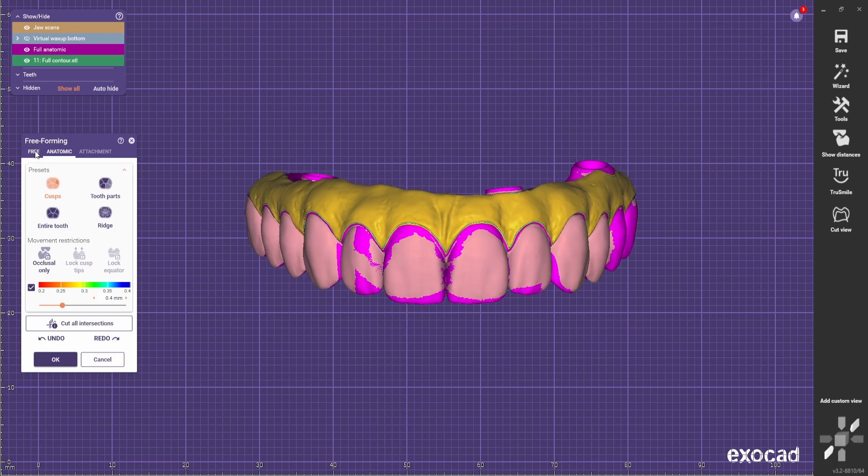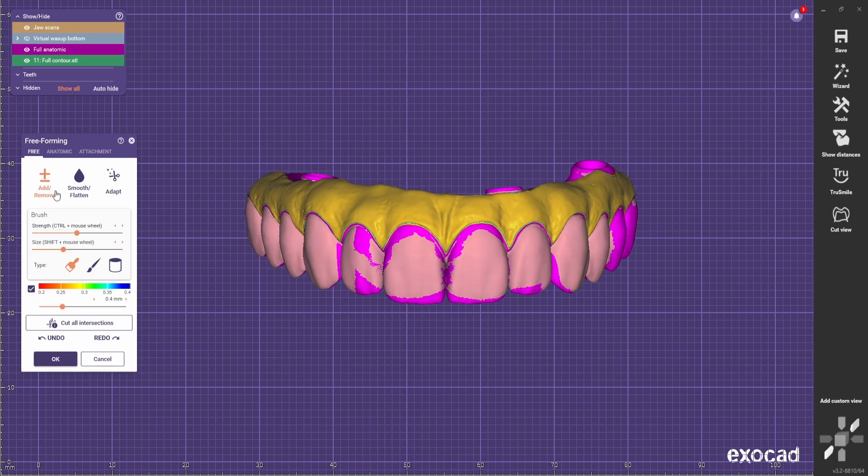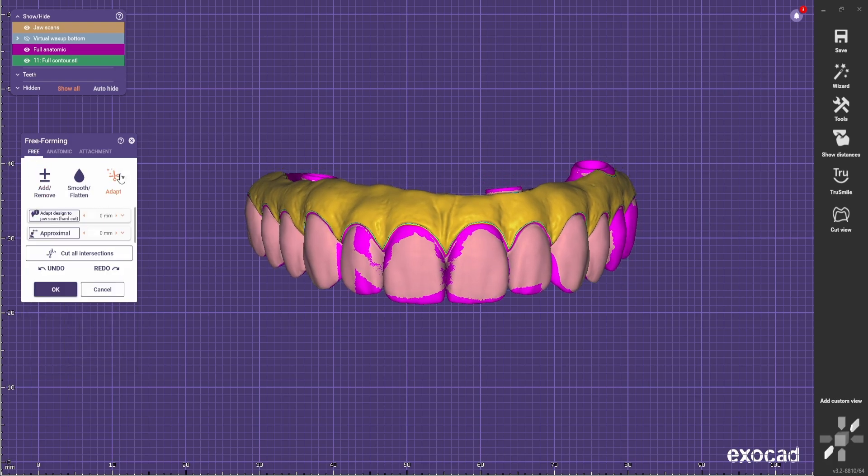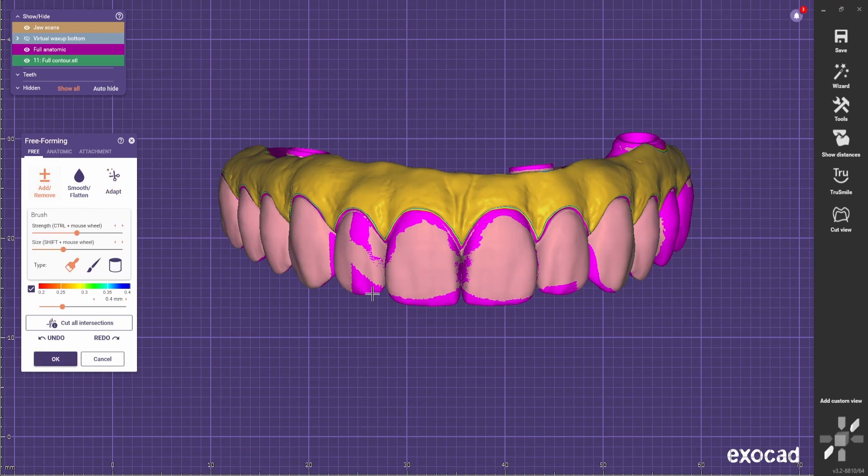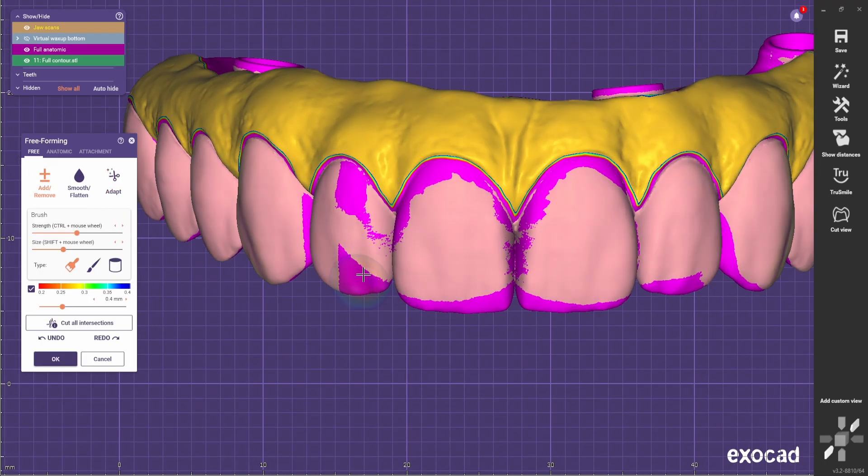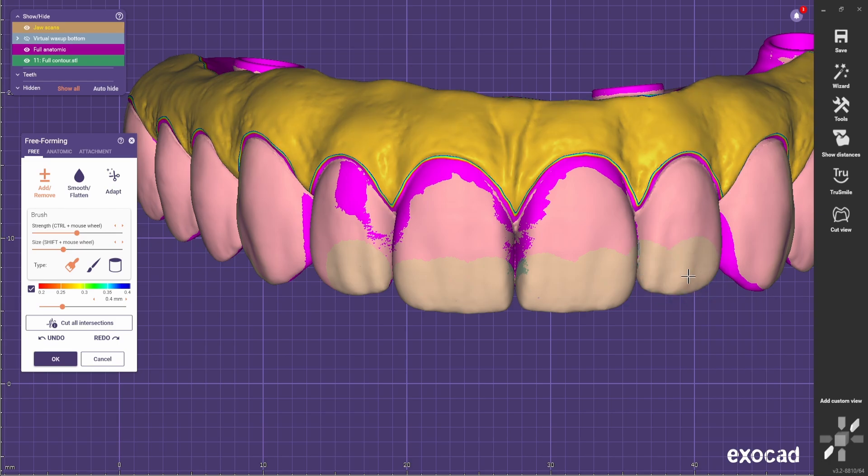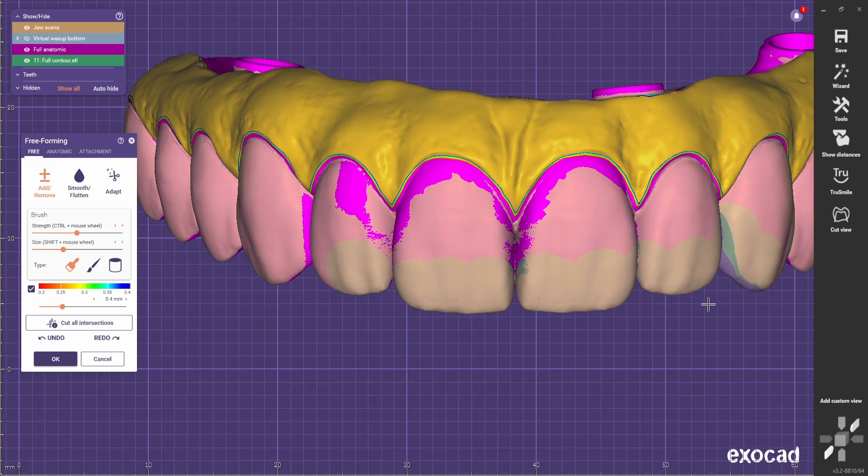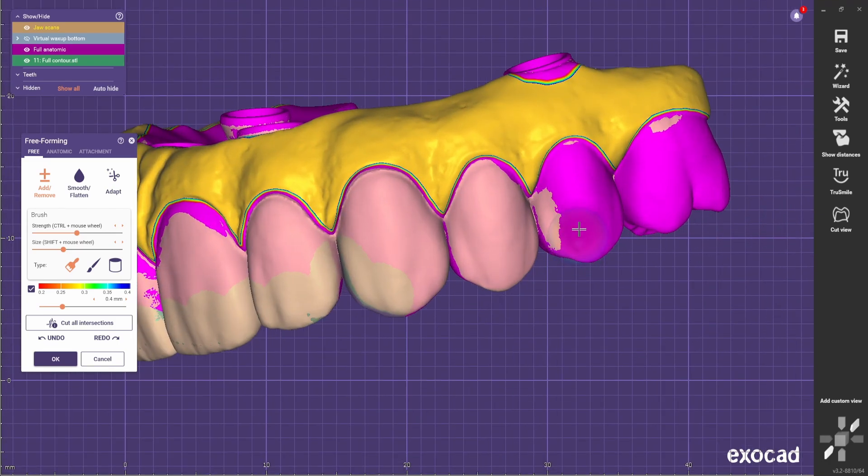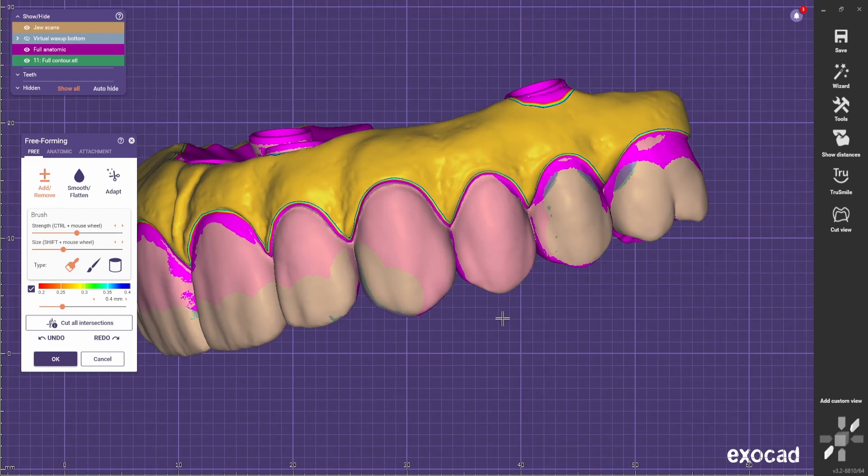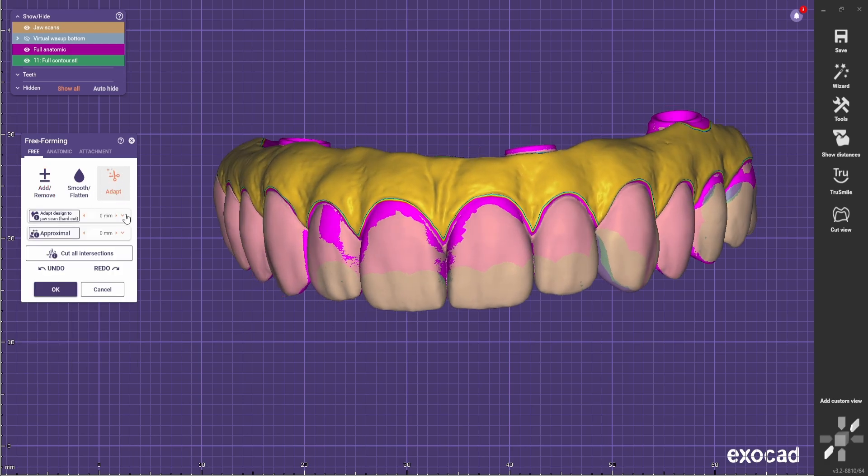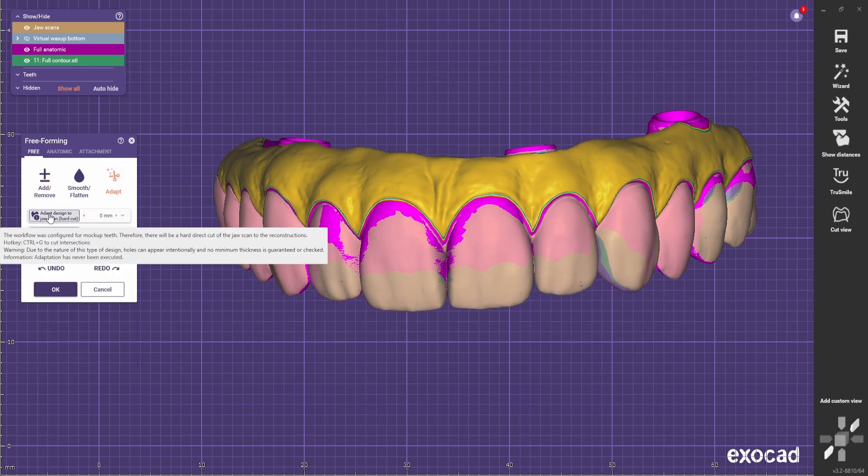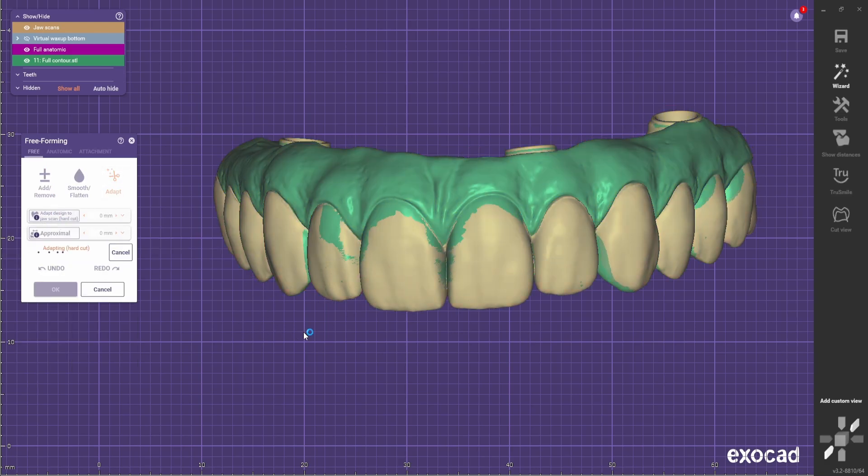And we go to free. You go to adapt and you're gonna choose this tool. Now you see these areas, you can smooth them out just so you don't have anything else other than the gingiva. And just to give you the example, I'm gonna adapt it now to see if it looks good.